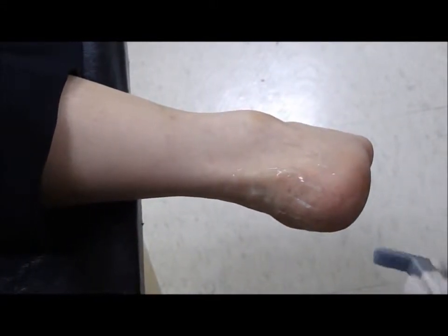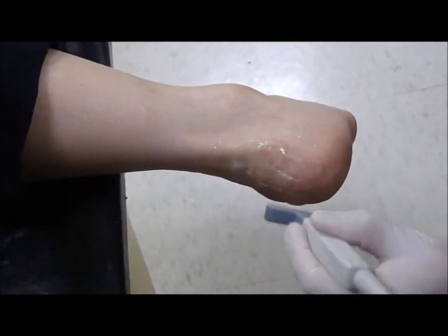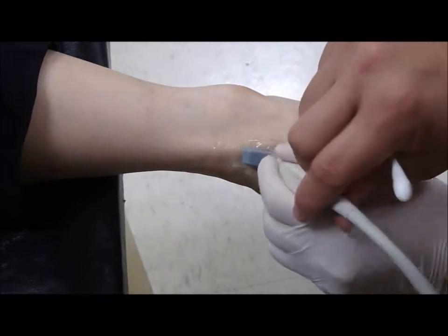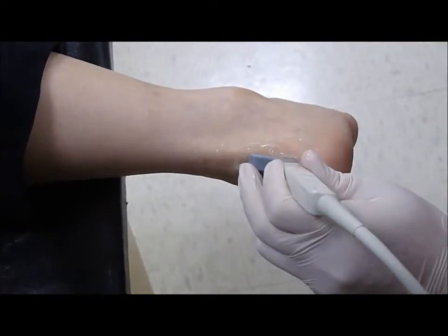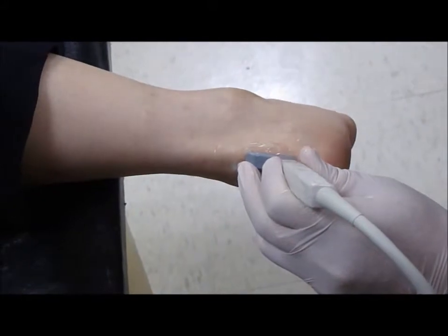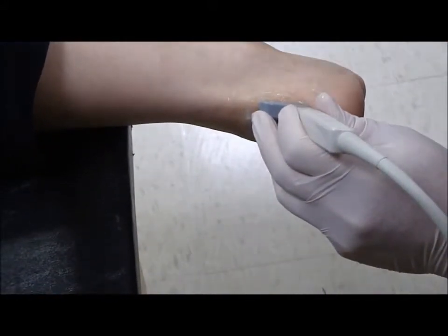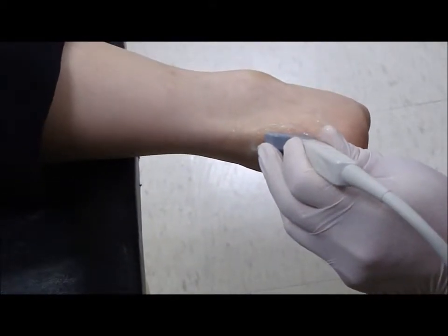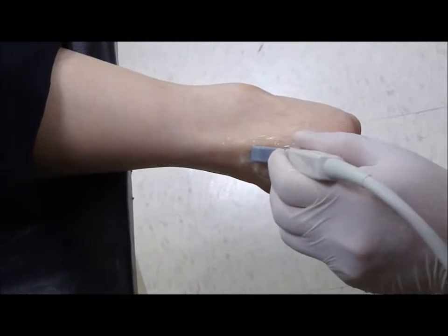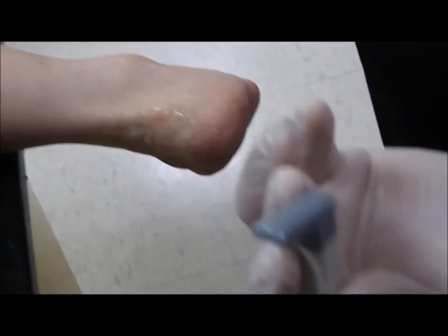This is the Achilles tendon. We first place the ultrasound transducer in the sagittal or longitudinal view to visualize the Achilles tendon and the retrocalcuneal bursa. For the examination of the retrocalcuneal bursa, we recommend the usage of a smaller transducer head, as you can see here.